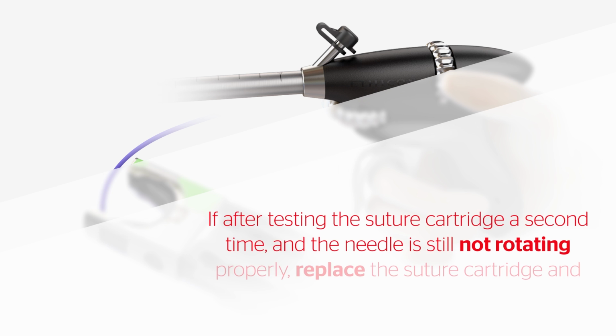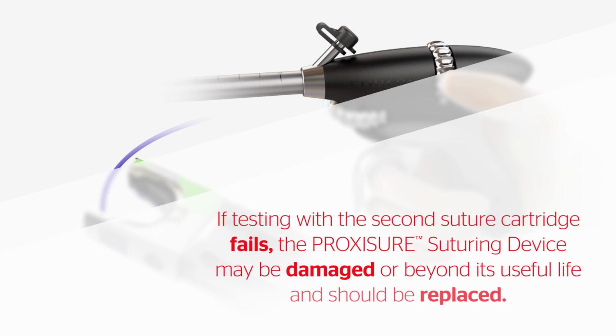If after testing the suture cartridge a second time the needle is still not rotating properly, replace the suture cartridge and repeat testing. If testing with the second suture cartridge fails, the Proxisure suturing device may be damaged or beyond its useful life and should be replaced.